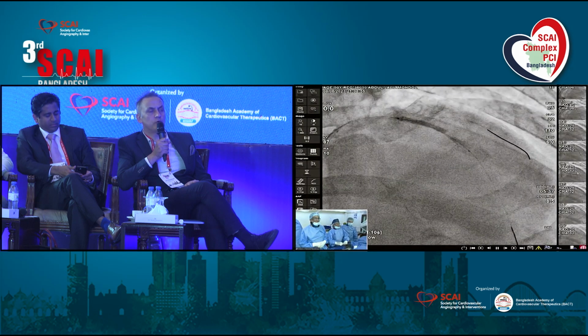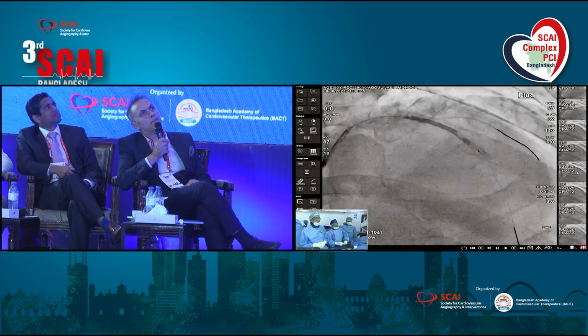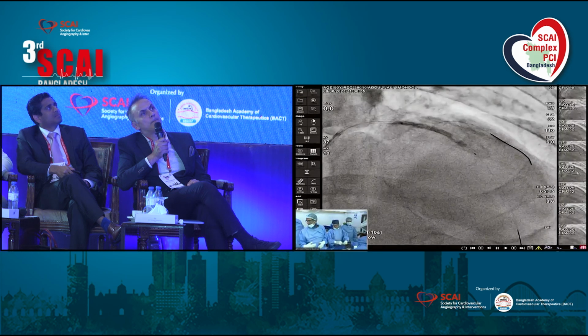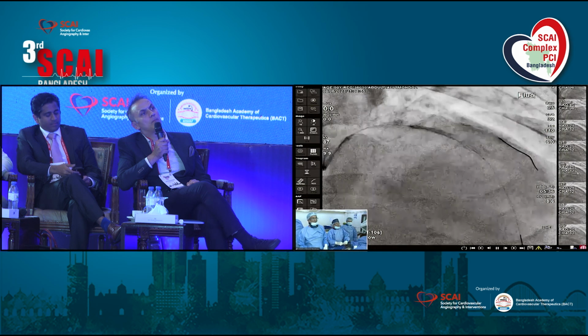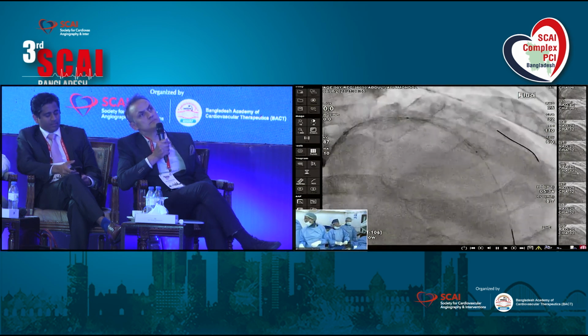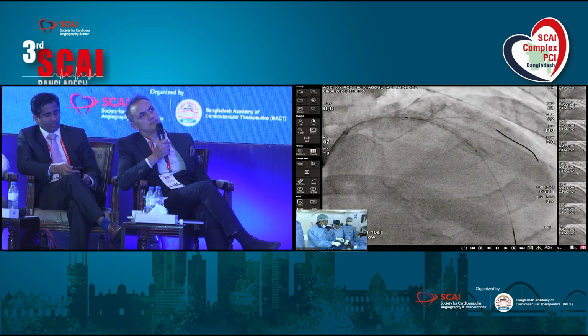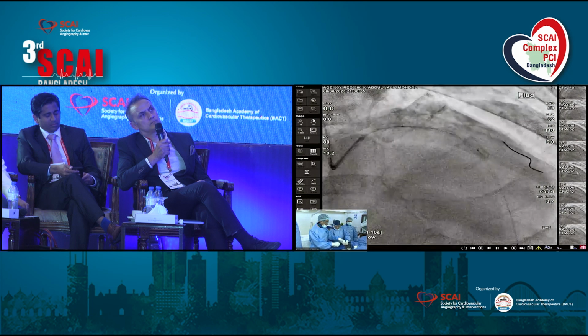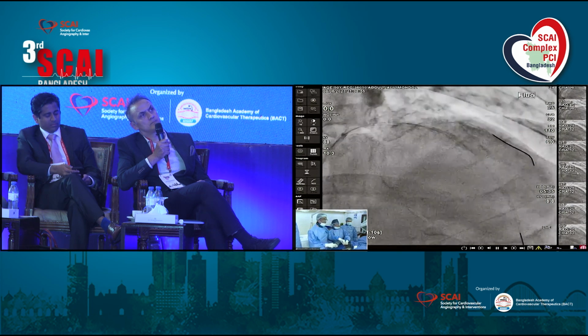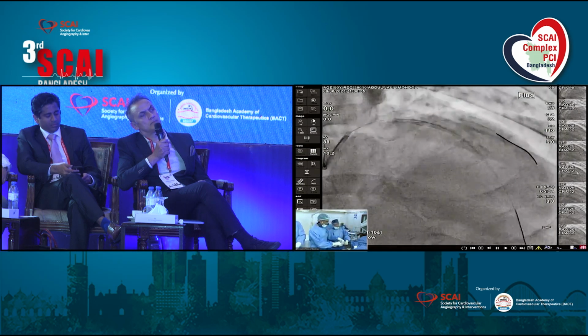So for predilatation, which size of balloon did you use? It is 2.75. What I like is to gradually increase: first 3, then 3.5, then 4. Somebody starts directly with a higher size like 4, but I personally prefer a gradual increase. Otherwise, sometimes I felt a strut fracture or there may be perforation, all of a sudden, given a larger size balloon.